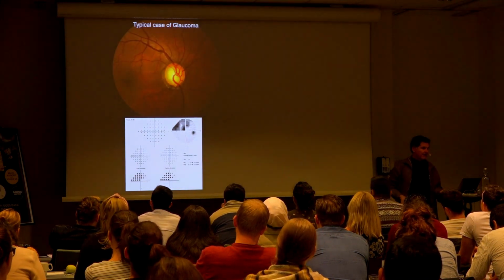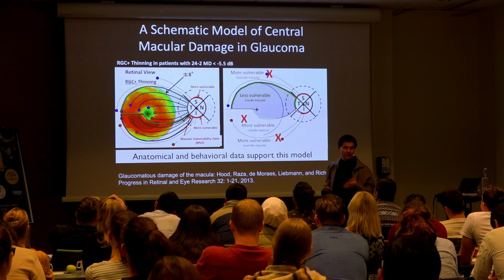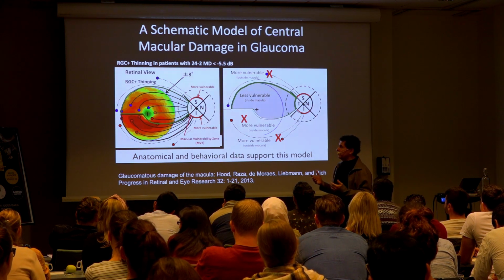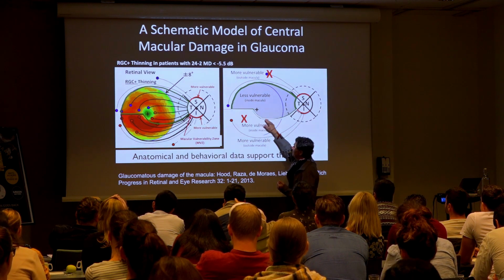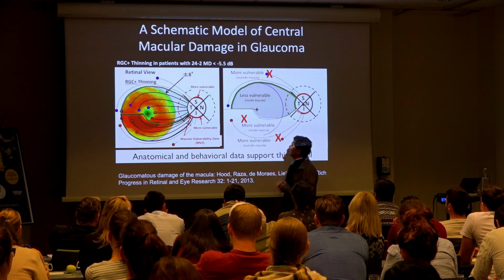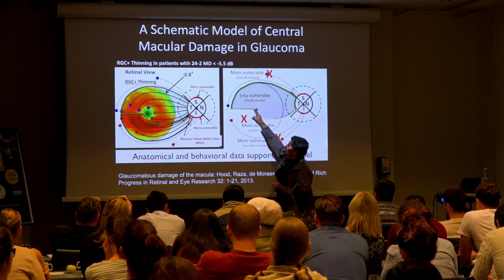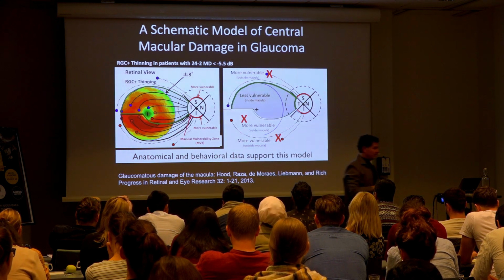And we were talking about using the Amsler grid for visual field when we did the confrontation yesterday. And that's another good use on those glaucoma patients. You'll see that you can pick up these macular arcuates within the central 10 degrees that come right up to fixation, but don't include fixation until late in the stage.